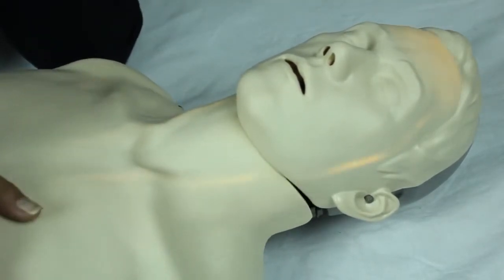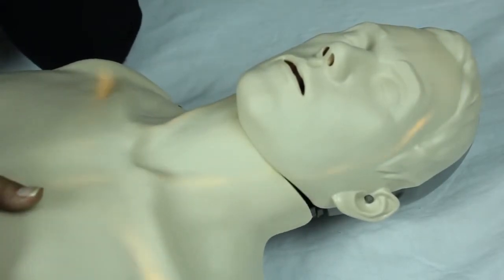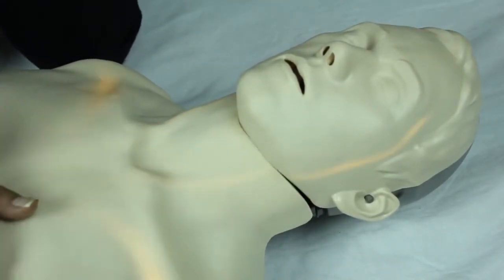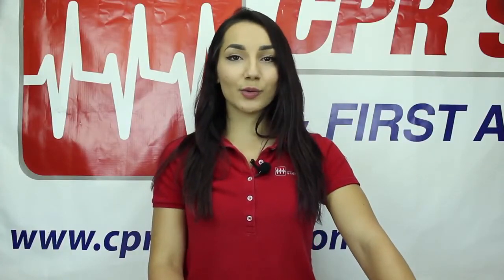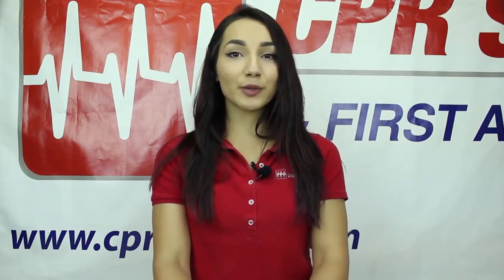The depth and speed of the chest compressions will determine the speed of the blood flow. At the top of the forehead is the normal circulation indication light, which will illuminate when the depth and speed of the compressions are correct. When performing chest compressions, the goal is to ensure that blood is getting to the brain, and this practice mannequin will help to ensure proper form is being executed to do so.